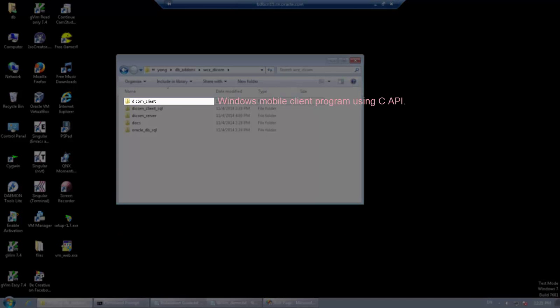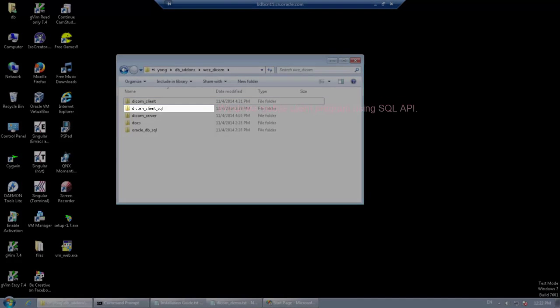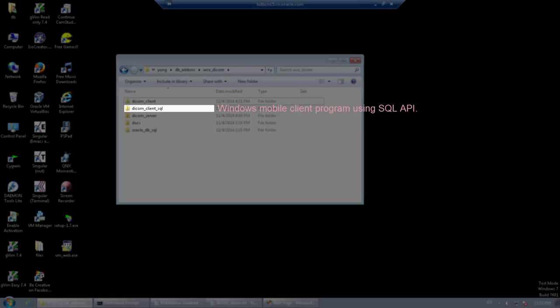The DICOM Client Directory contains the source code for a client program deployable on Windows mobile devices implemented with the Berkeley DB C API. The DICOM Client SQL Directory contains the same client program implemented with the Berkeley DB SQL interface.